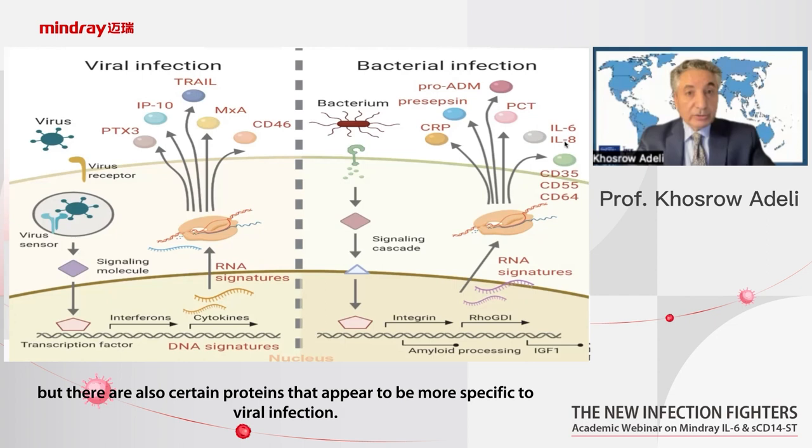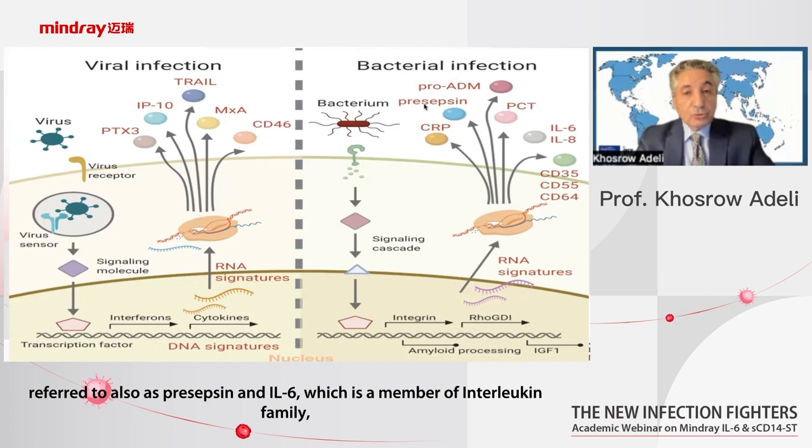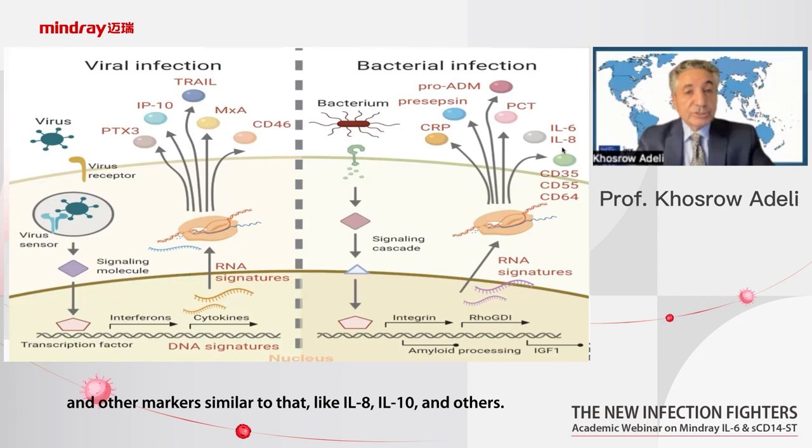So today we'll be hearing presentations on a number of these markers, particularly CD14 soluble form, referred to also as presepsin, and IL-6, which is a member of the interleukin family, and other markers similar to that, like IL-8, IL-10, and others.